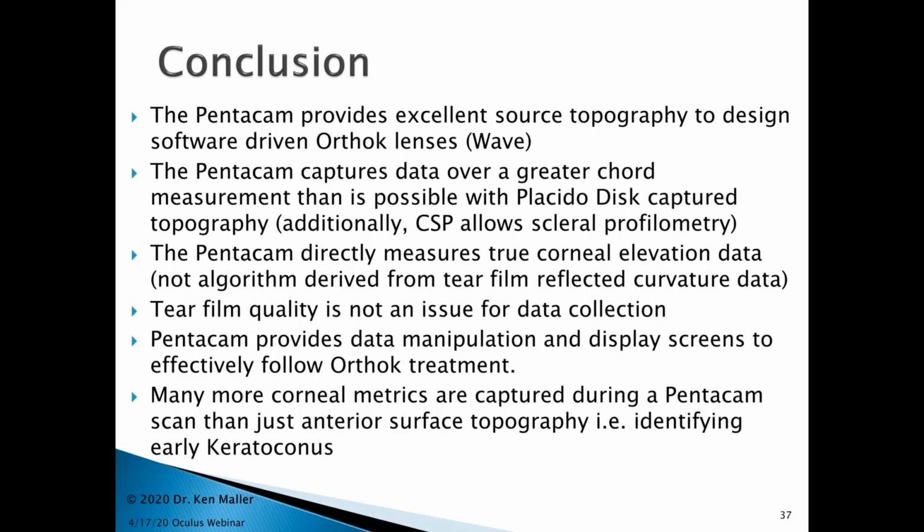And as such, tear film quality is not an issue for collecting data, which is an enormous benefit for this instrumentation. It provides data manipulation and display screens to effectively follow Ortho-K treatment over time, and you get a wealth more corneal metrics during the Pentacam scan than just anterior surface topography, as we saw in this third particular case.